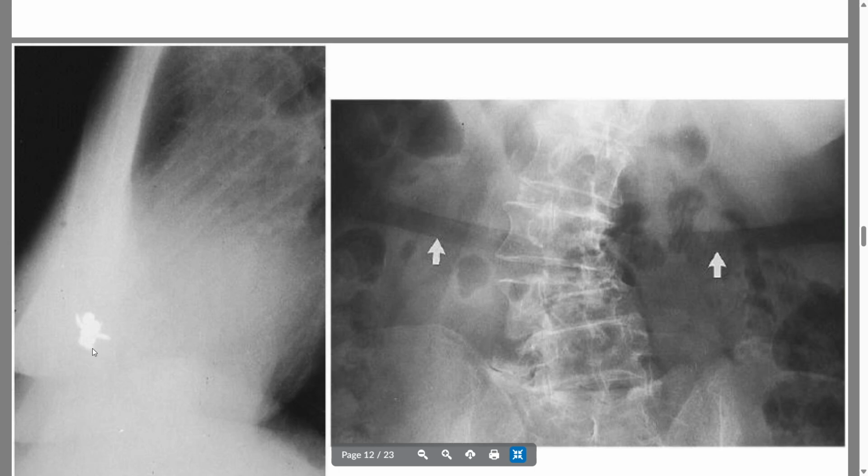And so we don't get a ton into how the CR machines work, but a lot of how the film works has to do with phosphors and silver and having those little molecules activated. So even though the bee isn't metallic and it's showing up as radio opaque, it made it so that part of the film couldn't be exposed to radiation, and therefore the silver and phosphor in that area couldn't be activated. So it made it look like it was metallic when it really wasn't. So that was just kind of cool.